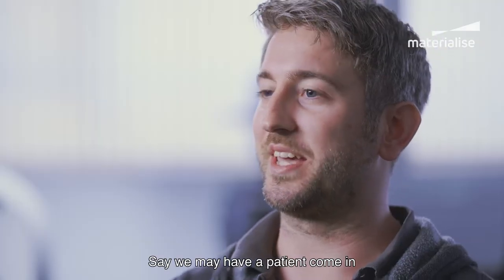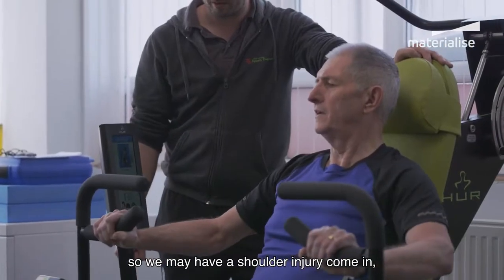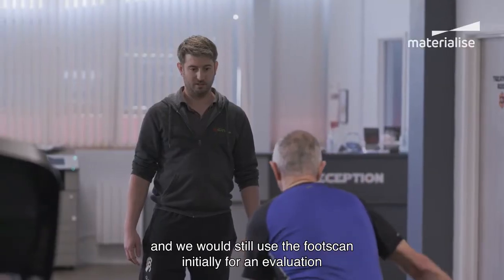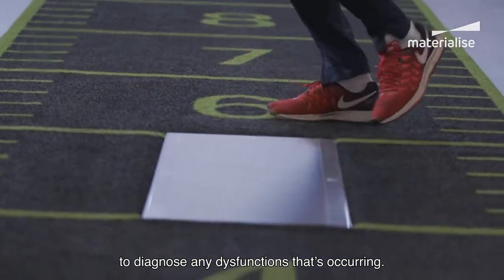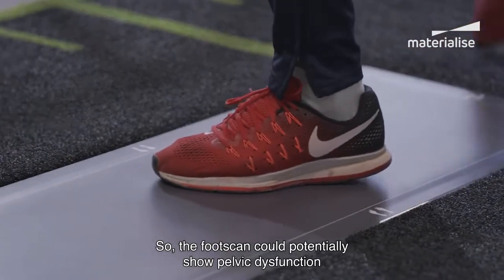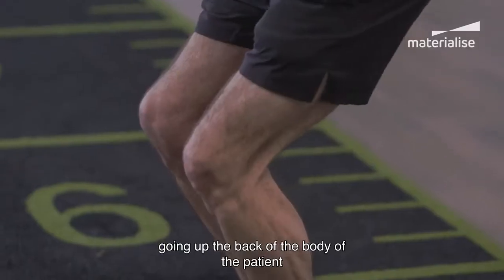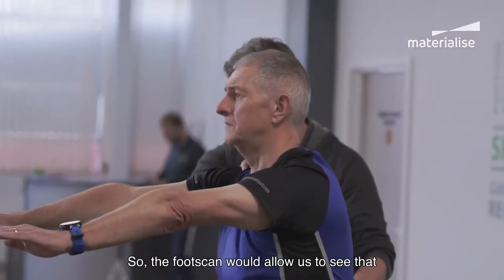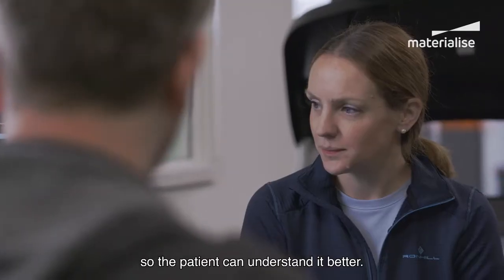A patient may come in with something that's not necessarily a foot injury — for example, a shoulder injury — and we would still use the foot scan initially for an evaluation to diagnose any dysfunctions occurring. The foot scan could potentially show pelvic dysfunction, which could affect the posterior sling going up the back of the body and affecting the shoulder. The foot scan allows us to see that and explain it more visually so the patient can understand it better.